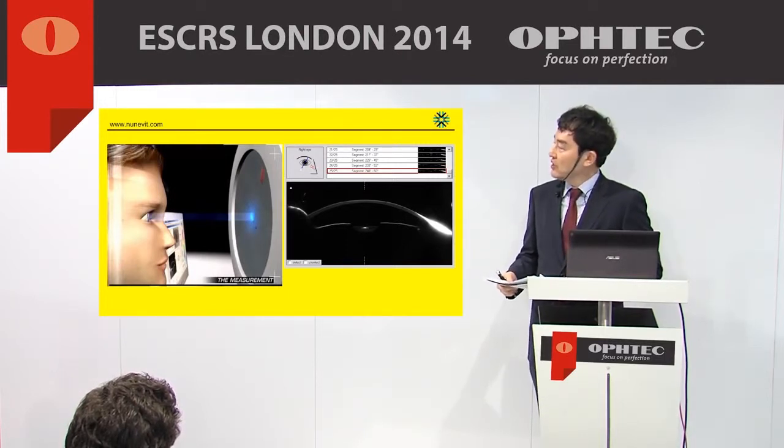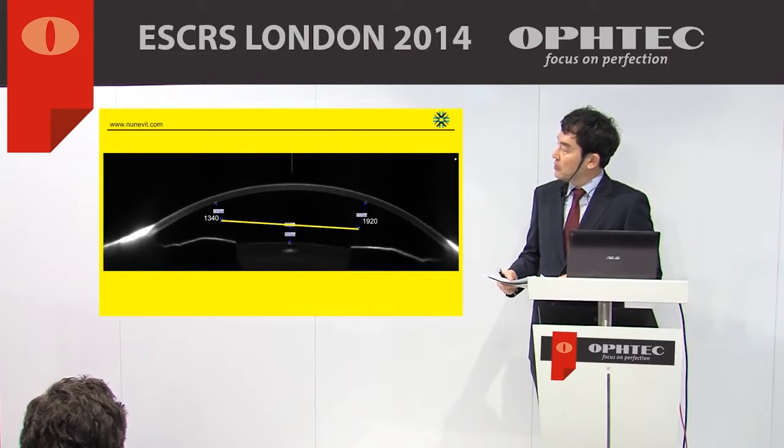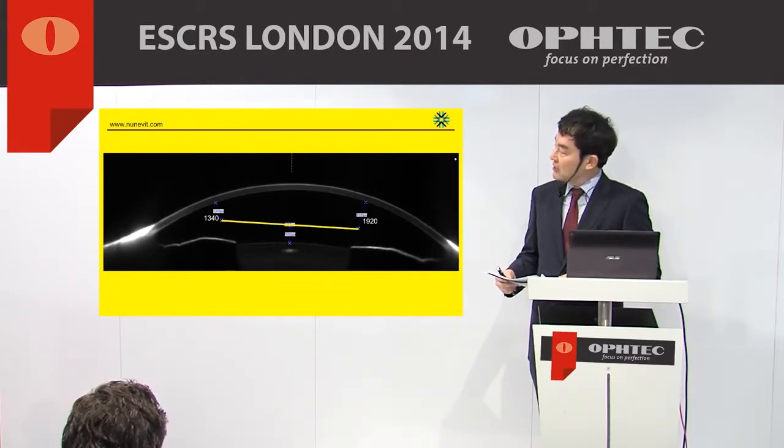First, draw a 6 mm line 1 mm above the crystalline lens and evaluate the critical distance. Since the Scheimpflug image depth value almost coincides with the OCT depth value, we can trust this result.